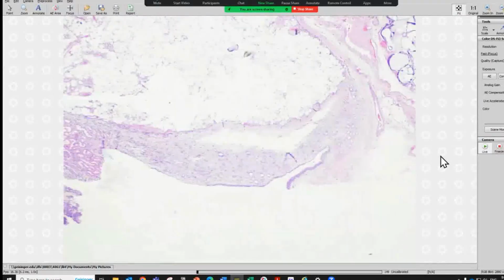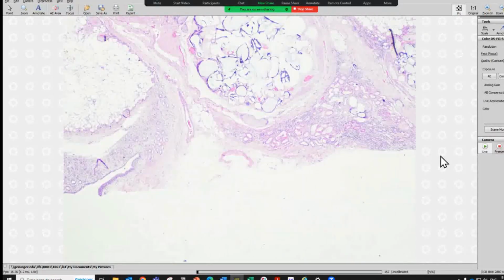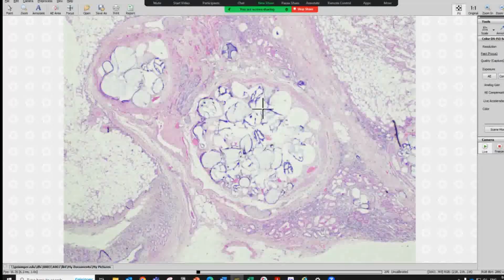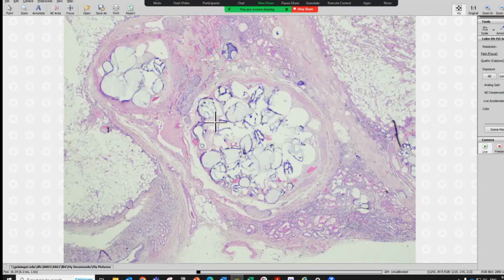Okay, let's focus on this area first. So, anyone know what it is? There's some weird material, I say this is a material. And then what is this structure? This circle structure. Yeah, this is embolization material. Do you know what kind of material? Any idea?